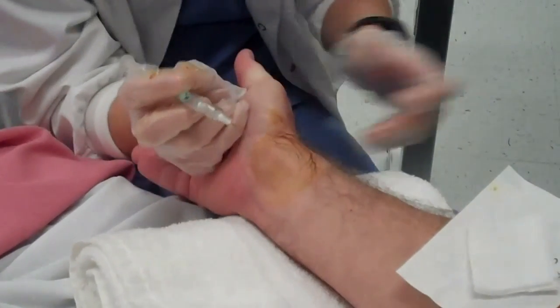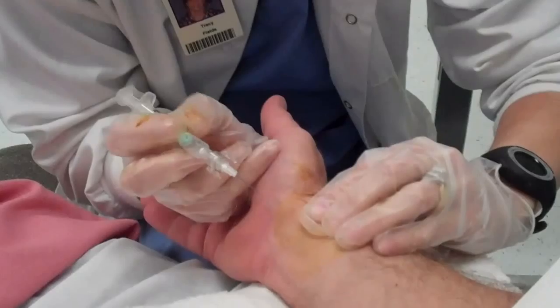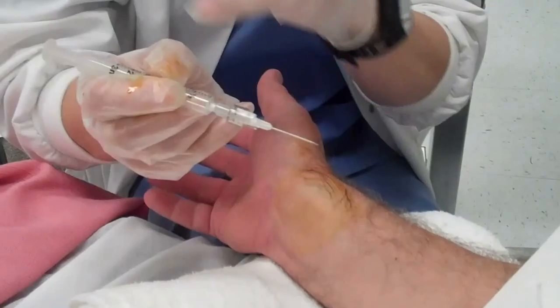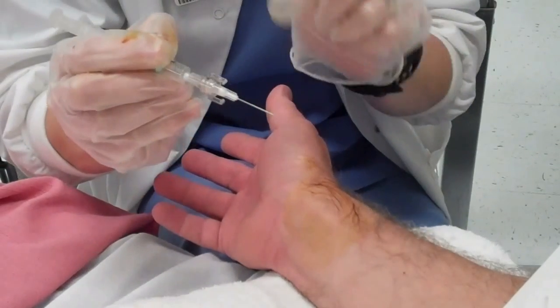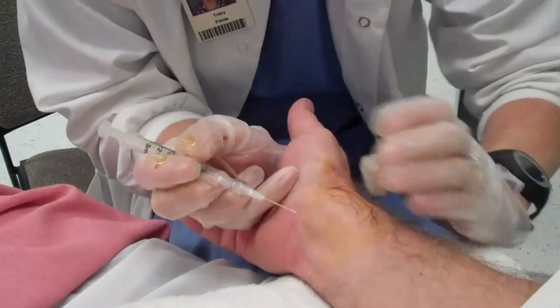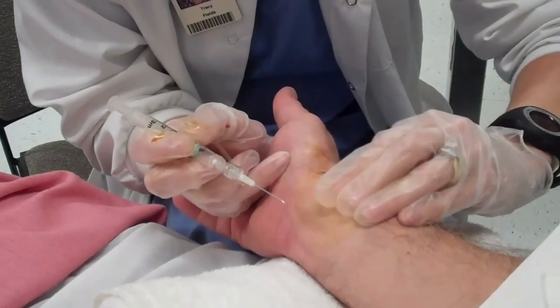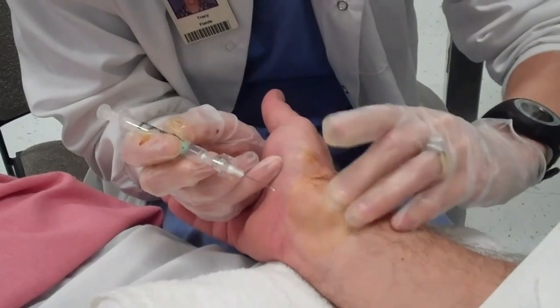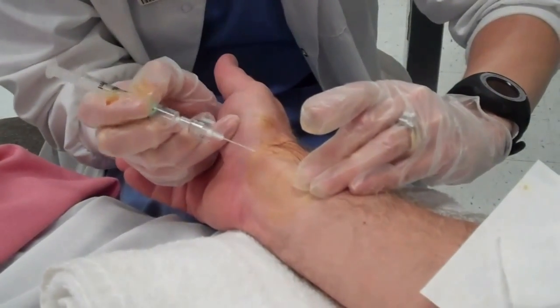Alright, Mr. Dunphy, if you'll just relax your hand for me. I'm finding the strongest pulse. You hold the syringe like a pencil. Make sure that you hold further back — you don't want to hold here because you can't see a flash when it comes into the syringe. I want to make sure that the bevel is up; that's the slanted portion. I find the vessel, find the strongest point, and then lift up. A lot of times I'll find myself tugging on the skin — if you have loose skin, it helps to stabilize the vessel.